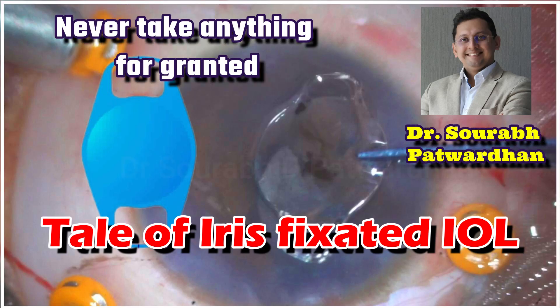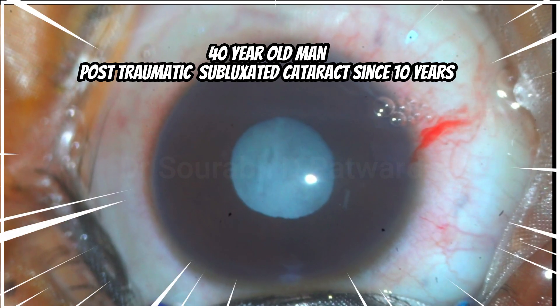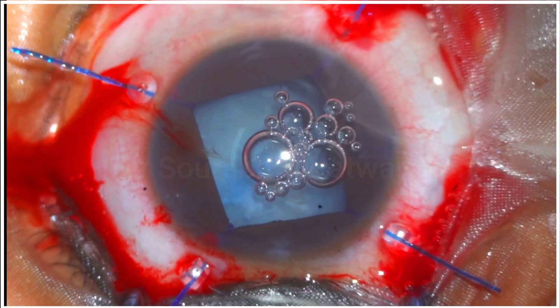This is a very interesting video and I am sure that you will learn a few things from it. This was a case of a 40-year-old man who had post-traumatic subluxated cataract for almost the last 10 years.